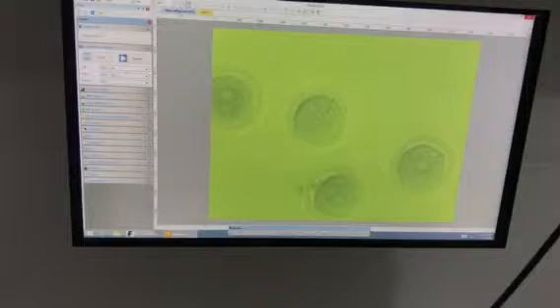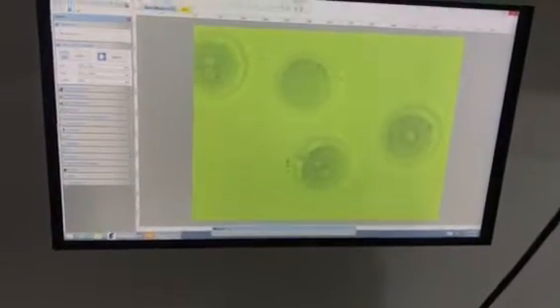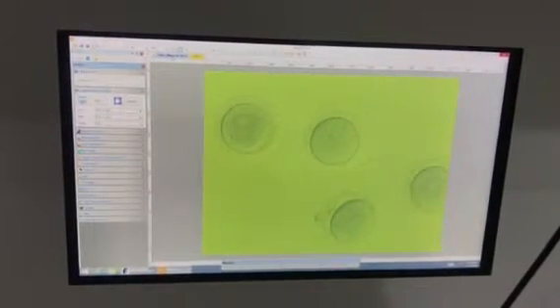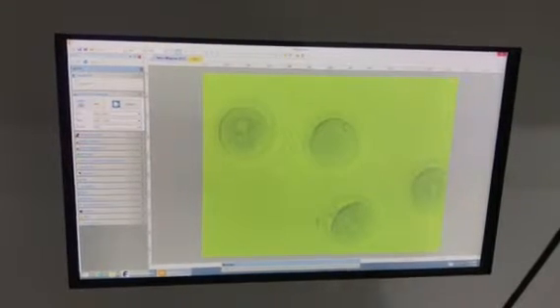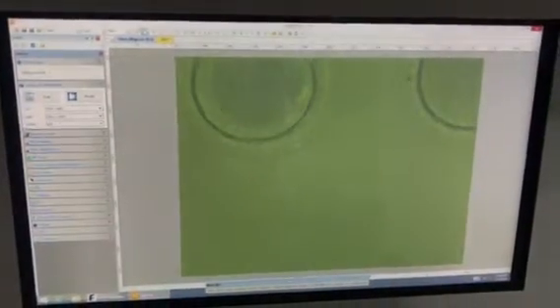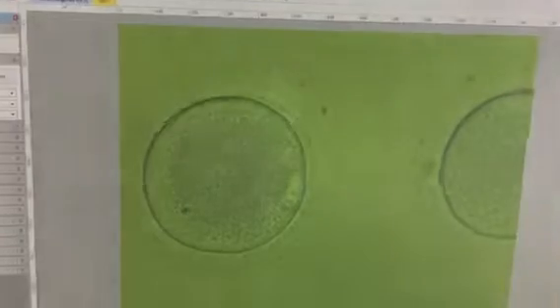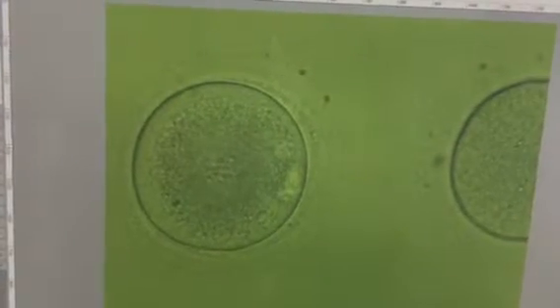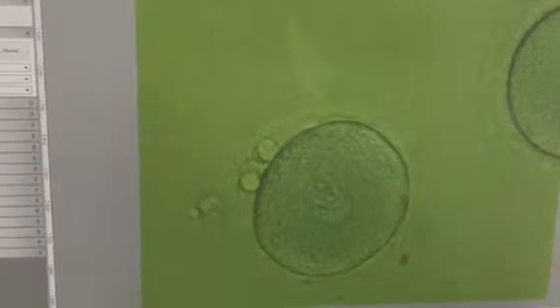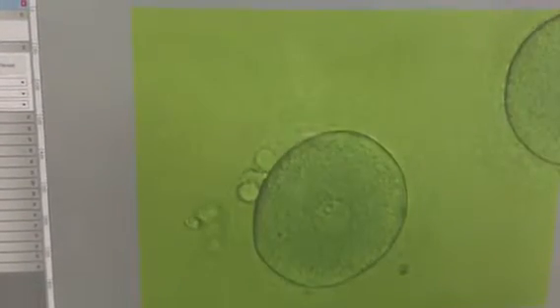Wow, nice. One has not fertilized. I don't know, and the nucleus arrangement also looks good, two polar bodies. Wow, this is really good. This one is not fertilized. After injecting also, I have observed how the sperm was deposited.